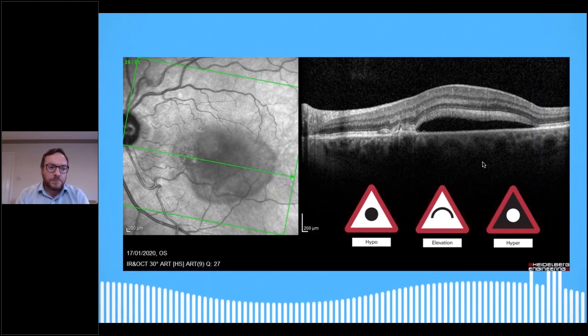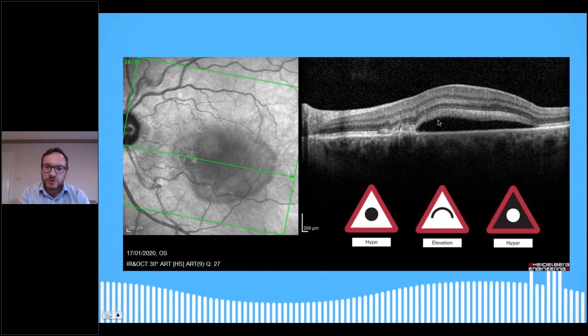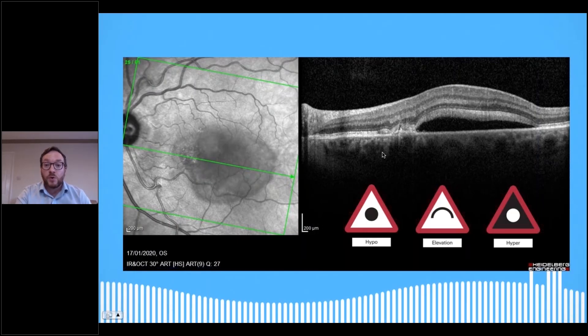Really important: don't jump in with your first diagnosis and go for the obvious. Make sure you take a systematic approach to looking at the whole image in front of you.